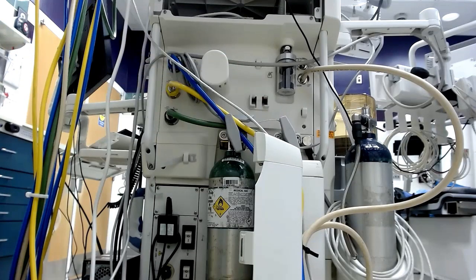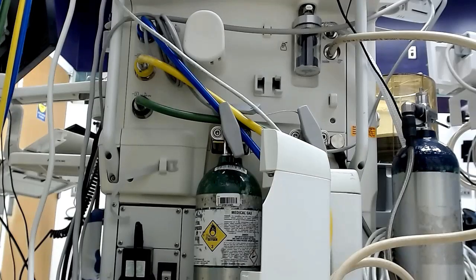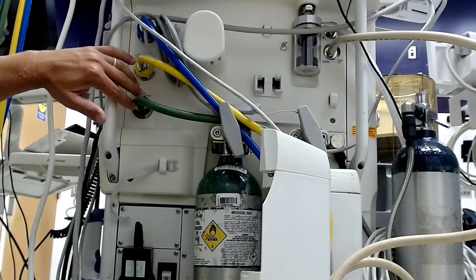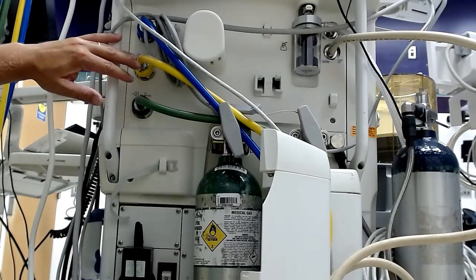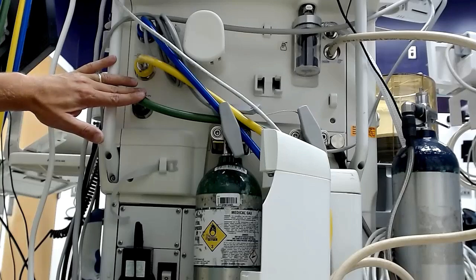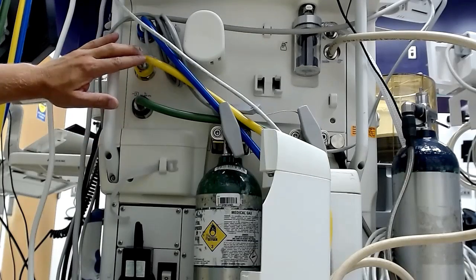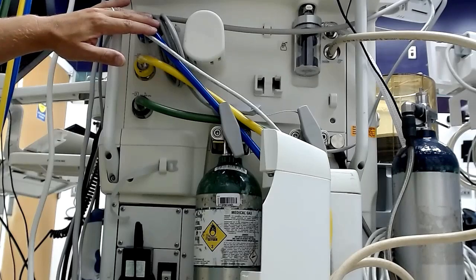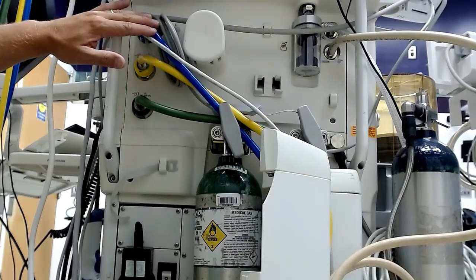Now, moving forward with some of our other devices, let me zoom in on this to see if we can get you a better image. Up here, you can see that this is where our pipeline enters. So this is oxygen, air, and nitrous oxide. Oxygen here on the bottom, which is green, air, which is yellow, and nitrous oxide, which is blue, which is coming from the wall unit or coming from our big H cylinders located outside of the facility.